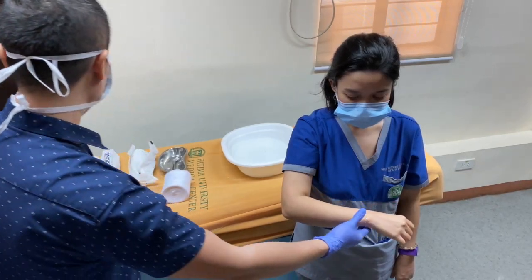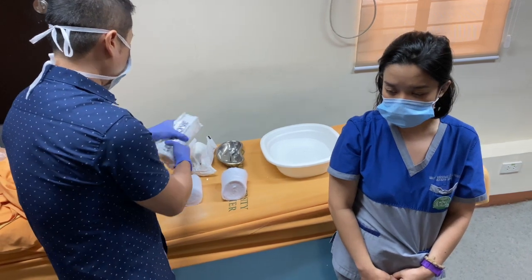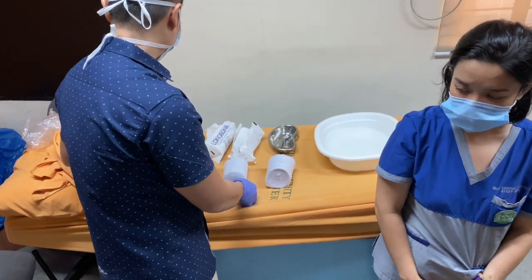So what do we need for doing the U-mold? First, we'll be using plaster of Paris — the old school type of casting.